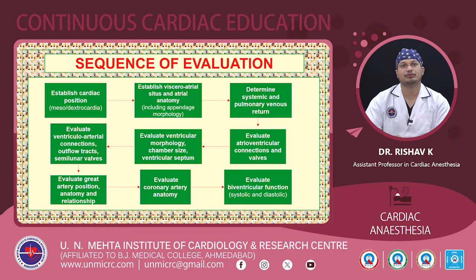So first and foremost, we will be establishing the cardiac position, whether it is levocardia, mesocardia, dextrocardia. Thereafter, we will be establishing the visceroatrial situs and atrial anatomy. Thereafter, we will be determining the systemic and the pulmonary venous return. Thereafter, we will be evaluating the atrioventricular connections and valves. Thereafter, we will be evaluating the ventricular morphology, chamber size, and the ventricular septum.